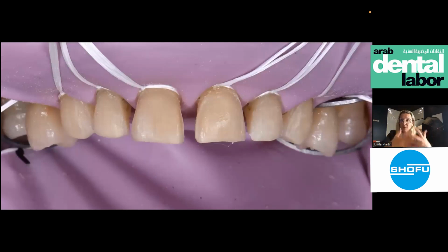For the anterior part, it's really, really interesting to do the palatal and the buccal at the same time, so you can stick. And I always begin with the two central incisors, because in this case, it must be really, really parallel and perfect for the smile. When you have the lateral incisors a little bit in rotation or longer, smaller, it's not so important. But the symmetry of the central incisors is really, really important for aesthetics, for the eye. When you see something aesthetic in the middle, it's okay. When you see something a little bit in rotation, it's okay. Lateral is not a problem. But central is really, really important.